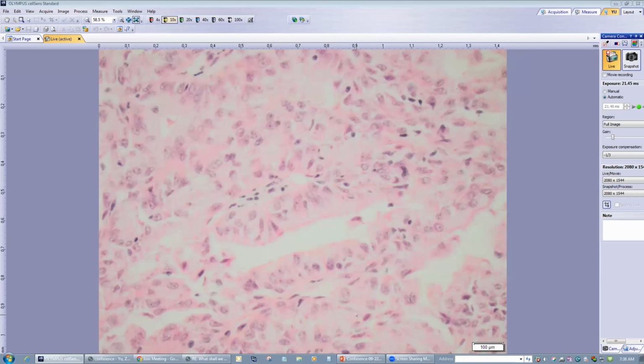So the cells consist of columnar cells. They have prominent, large nuclei, sometimes with prominent nucleoli. And there's what we call voluminous cytoplasm, a lot of cytoplasm. Usually when you look at lower power, the tumor looks very pale because of so much cytoplasm. The cytoplasm is usually pink to clearing.